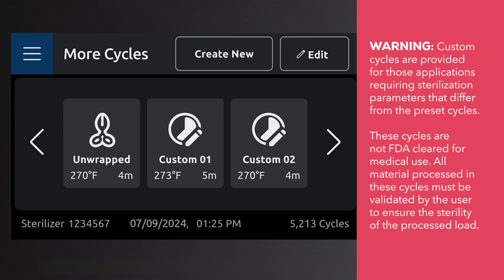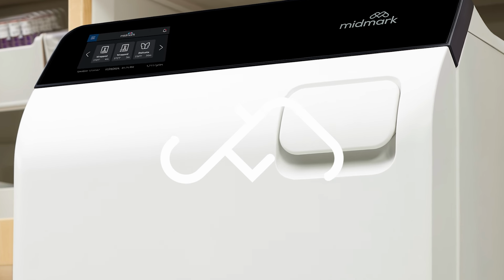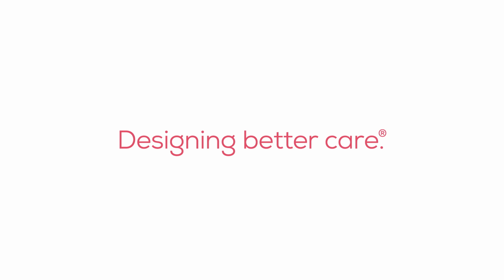These cycles are not FDA cleared for medical use. All material processed in these cycles must be validated by the user to ensure the sterility of the processed load. For more detailed information about your sterilizer, refer to the Midmark Steam Sterilizer Setup and User Guide.